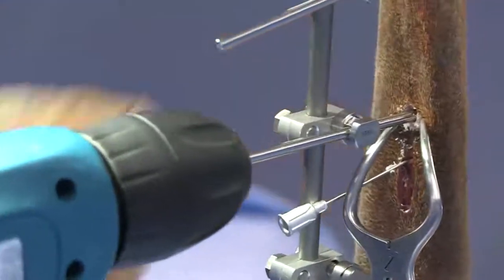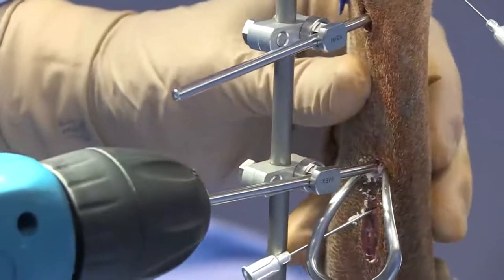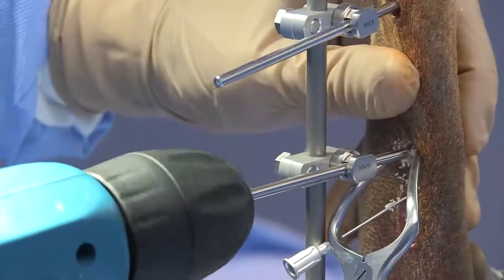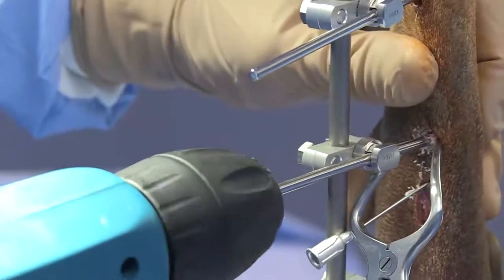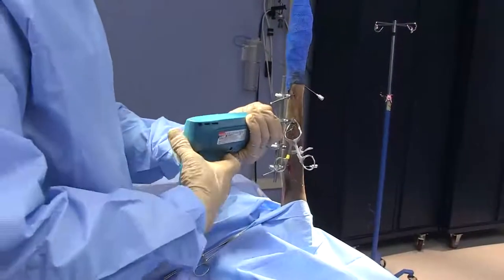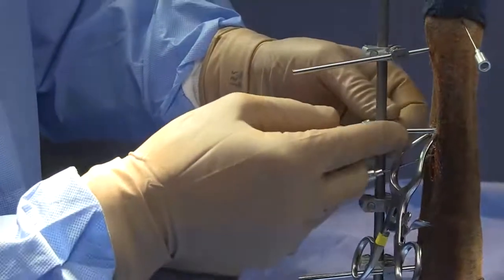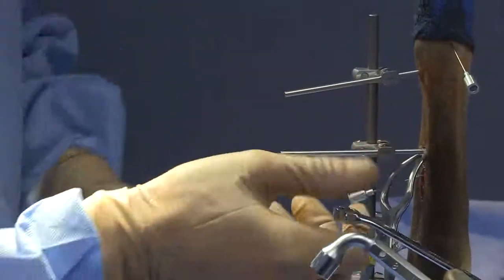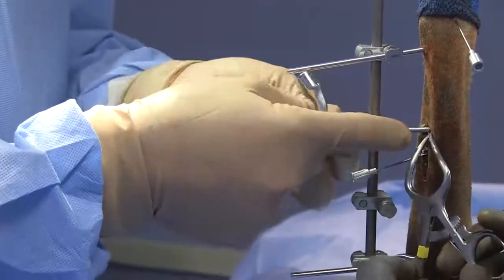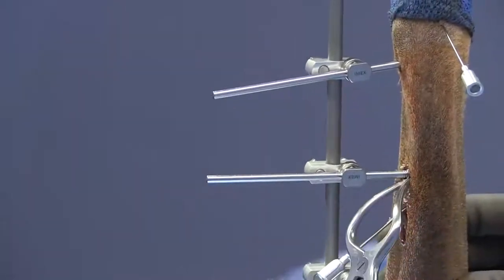If you've gone too far with the pin, you can back it out — though that does reduce the pullout strength a little bit. But if that's at the expense of the animal's comfort, it's worthwhile, especially if it's sticking out prominently or touching against the skin. Just like we did with the other clamps, we can get that tightened down a little bit. We're not going to engage this too tight yet until we get our last pin in, then we'll show you how we use two wrenches together to counter-torque those clamps to get them nice and snug.